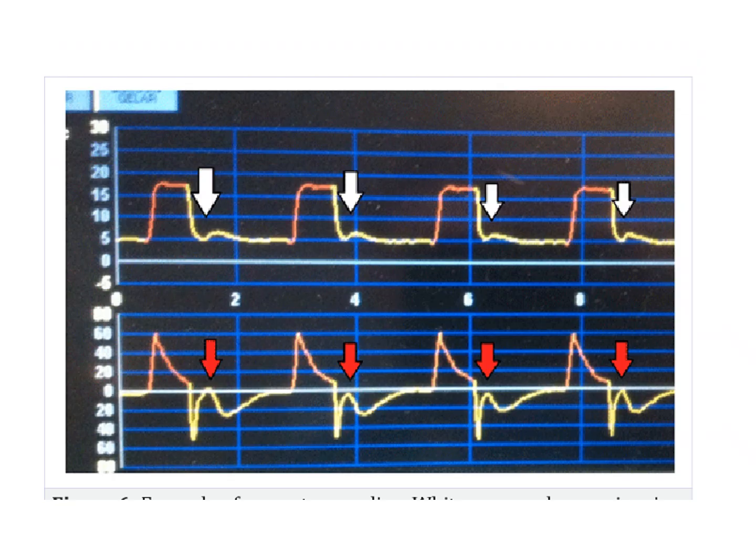Same is the problem in pressure control, because in pressure control we set the inspiratory time. So the patient might want to have a longer inspiration than what you are giving. In this patient, you can see that there is an effort immediately after inspiration. This is because whatever inspiratory time you are giving is not sufficient. The patient wants a longer inspiratory time, and this is called cycling asynchrony. So you have to increase the inspiratory time. Cycling asynchrony and reverse asynchrony, we have discussed the reverse asynchrony.